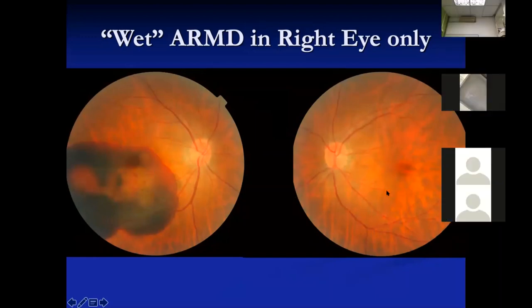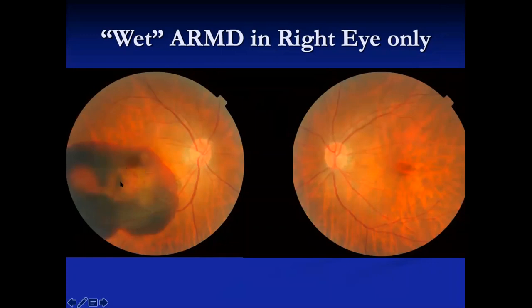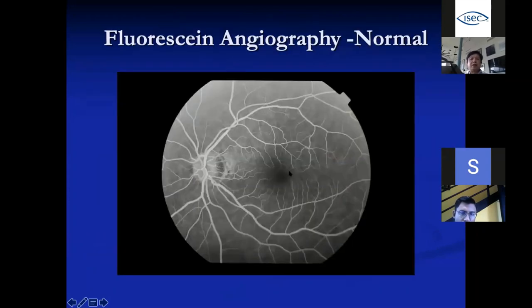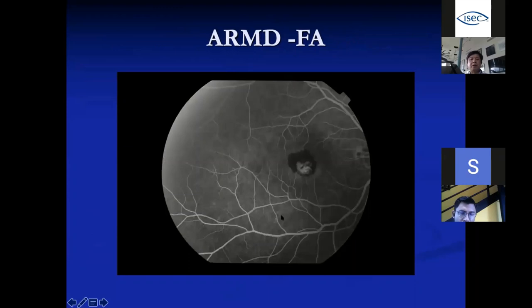In the old days, fluorescein angiography was used to diagnose abnormal blood vessels (CNV). On a normal angiogram, there should be no fluorescence in the center; abnormal fluorescence in the center confirms abnormal blood vessels, while dark areas represent masking from blood. OCT now gives us a cross-section to visualize this directly. On first-generation OCT you can see the swelling and the abnormal blood vessel layer under the retina causing leakage. With modern high-resolution OCT, we can diagnose CNV confidently without needing an angiogram in most cases.